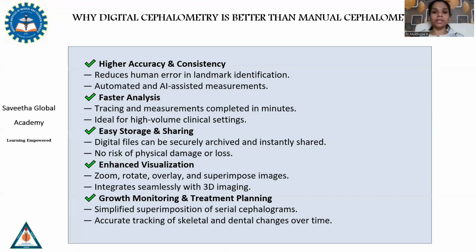You don't have to work for the whole day, keep tracing. Instead, with the software, whether it is a semi-automated or a completely automated version, you either have to mark points or you have to basically calibrate this ceph so that the software can help you in marking the points. Next, the easy storage and sharing options, because the digital platforms, as we all know, come with cloud storage, the digital files can be securely archived and instantly shared with any fellow dentist. There is no risk for physical damage or loss.